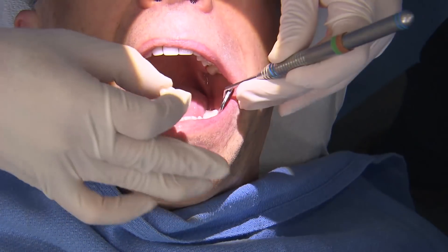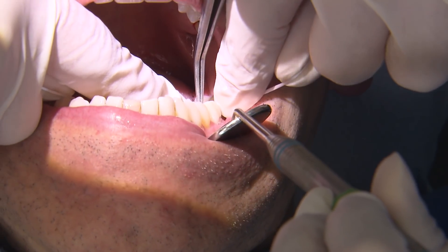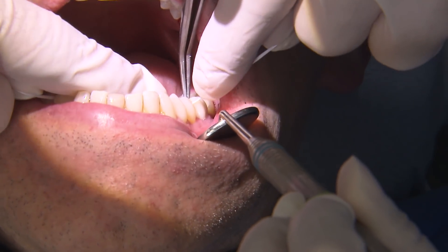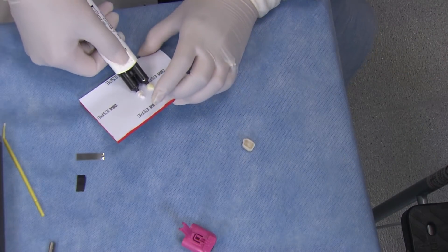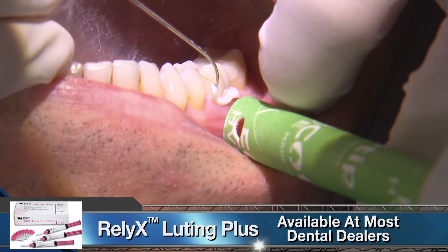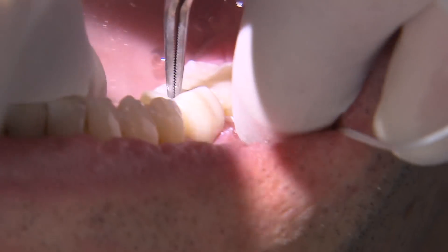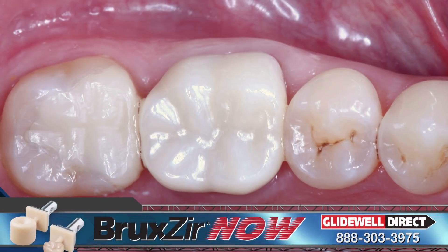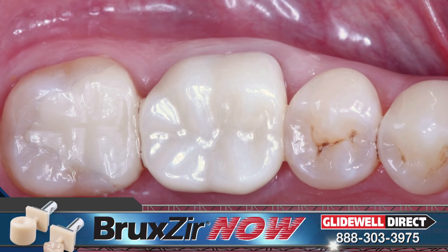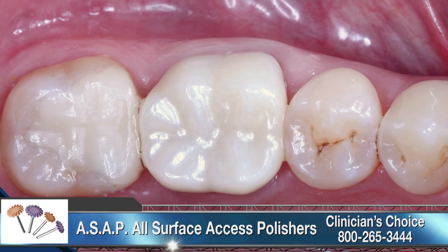We now have the lower crown finished and ready to try in once the sprue is removed. When the correct parameters are dialed in on the software, there is very little to no adjustments needed to the proximal contacts. We cement this crown in place using 3M's resin-modified glass ionomer, Reliax Looting Plus. The excess is easily removed when it enters a gel state after 2 minutes. These restorations come right off the mill with a very nice surface finish. For this lower crown, I polished the surface using Clinician's Choice All Surface Access Polishing Kit.